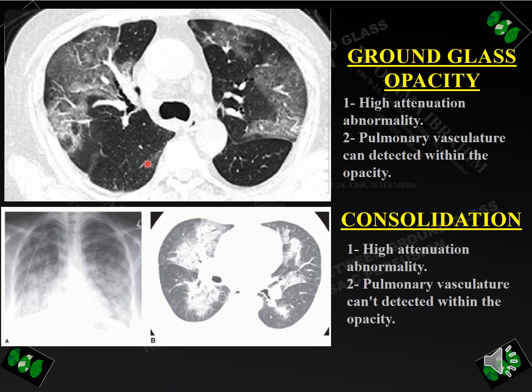This area of alternating white and black areas in the lung represents abnormal lung parenchyma. The white area represents high attenuation and the black area represents low attenuation. The dilemma is: which area is the abnormal area? If the blood vessels are equal in size in the low attenuation area compared to the high attenuation area, we consider the high attenuation — the white area — as the abnormal area, which is ground glass opacity. Comparing with another abnormal area, ground glass opacity due to consolidation.